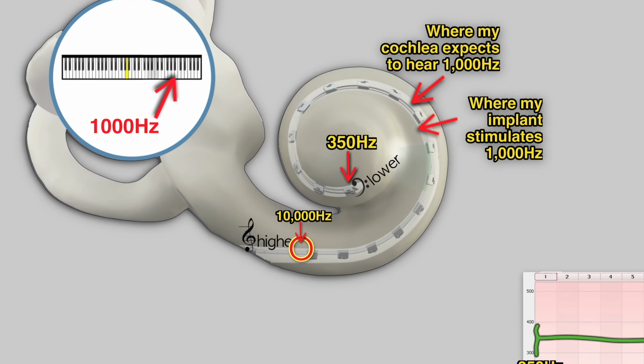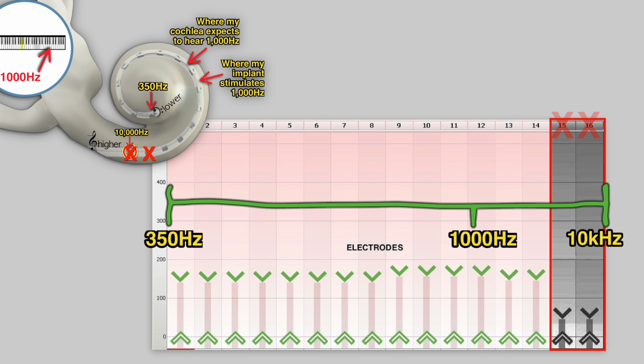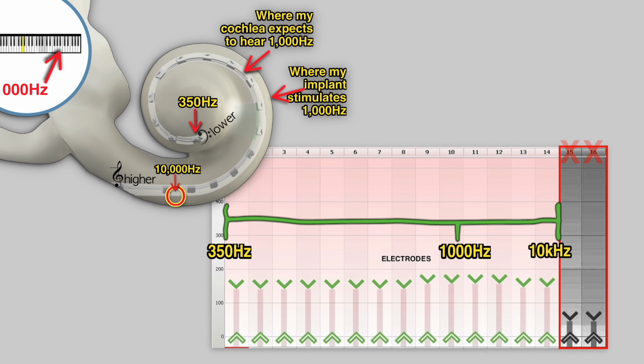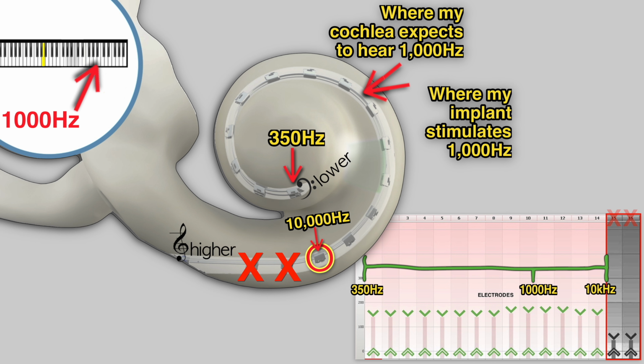And this is where my experimental program came in. My audiologist agreed to turn off the two electrodes that stimulate the outer portion of my cochlea, numbers 15 and 16. The theory is that the processor would redistribute all of the frequencies between the remaining 14 active electrodes, which would mean that any given frequency stimulation would occur just a little bit further down in my cochlea, where it might better match the place coding of my tonotopic organization, and with the temporal coding for that frequency.